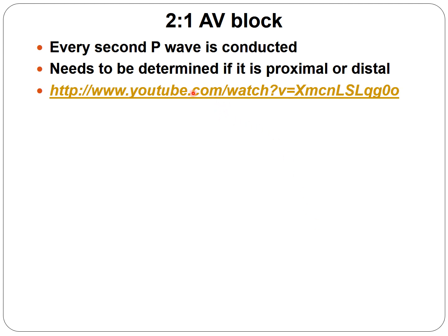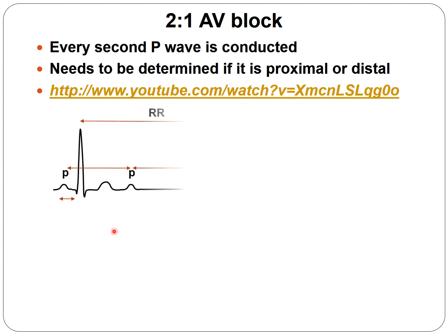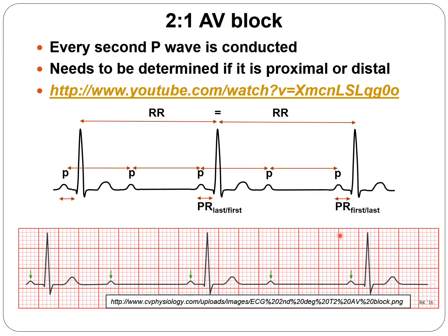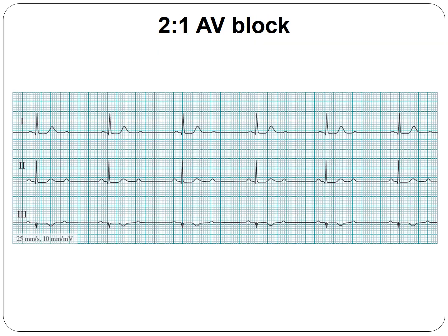In a 2:1 AV block, every second P is not followed by a QRS. Clinically, this is considered a serious situation and a pacemaker is usually implanted immediately, though it should be determined whether it is Mobitz Type 1 or 2. The rhythm is regular but bradycardic, with twice as many P waves as QRS complexes. The green arrows show the P waves, and the QRS complexes are very slow.